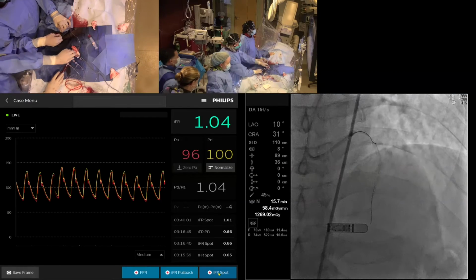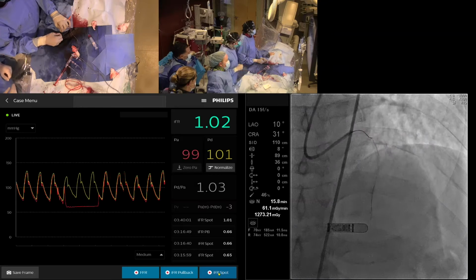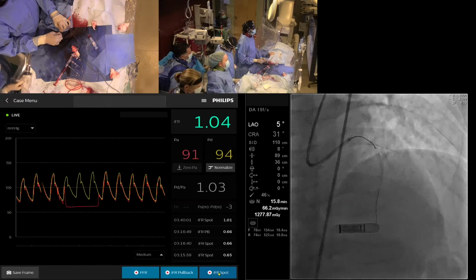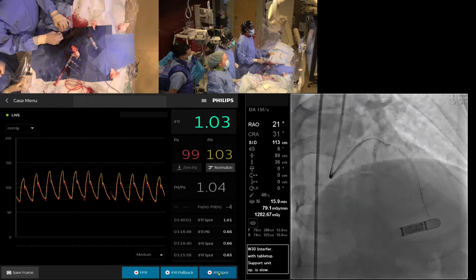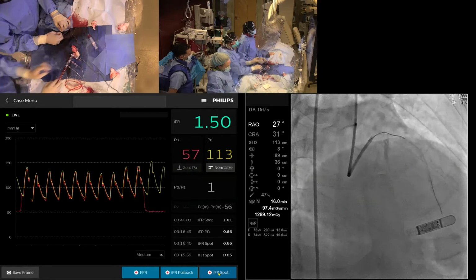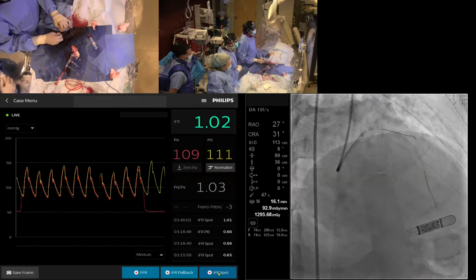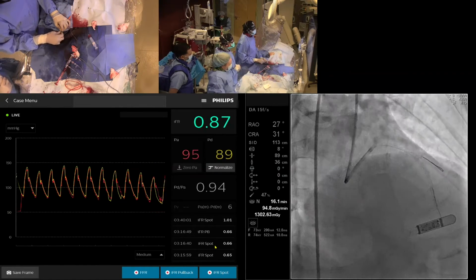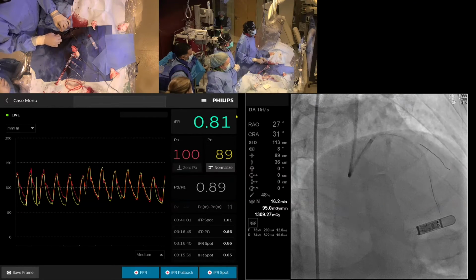That's it, right? I think it's a little bit more proximal. It's hard to see in this view, to be honest with you. You want me to go to the other view? Sure. Let's just see what the height is here. Let me come over here. Okay. Yeah, it's right there. There it goes. Okay. I don't want to buckle the loop. Is it good? Okay. Yeah, here we go. Wow, look at that. Beauty. Take my wire back. It's good.